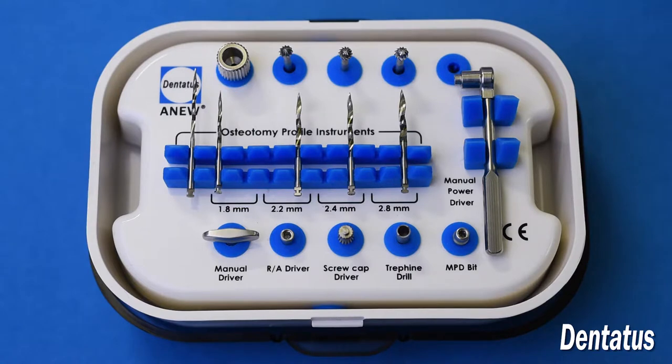Here we have the Dentatus ANEW surgical kit, item number SK-5. It contains everything you need for the Dentatus ANEW implant system.